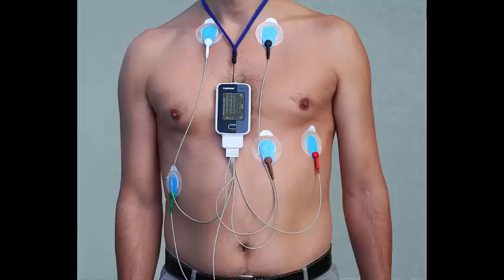Ambulatory ECG. Continuous ambulatory ECG recordings can be obtained using a portable digital recorder. These devices usually provide limb lead ECG recordings only, and can record for between 1 and 7 days. Ambulatory ECG recording is mainly used in the investigation of patients with suspected arrhythmia, such as those with intermittent palpitation, dizziness or syncope. For these patients, a 12-lead ECG provides only a snapshot of the cardiac rhythm and is unlikely to detect an intermittent arrhythmia, so a longer period of recording is useful.